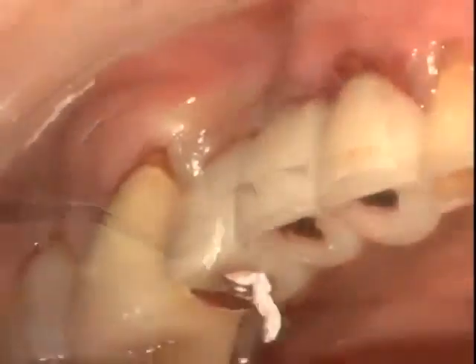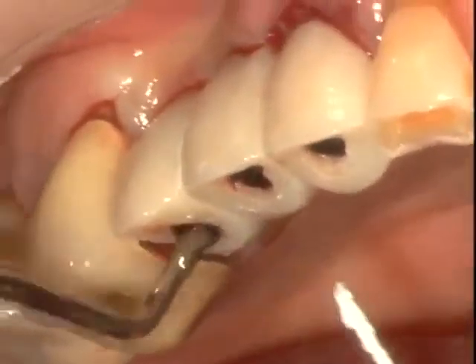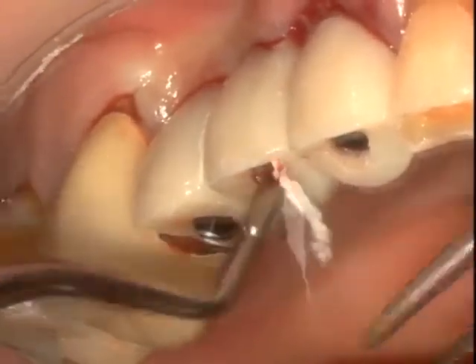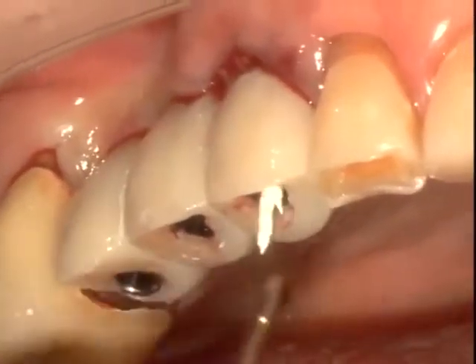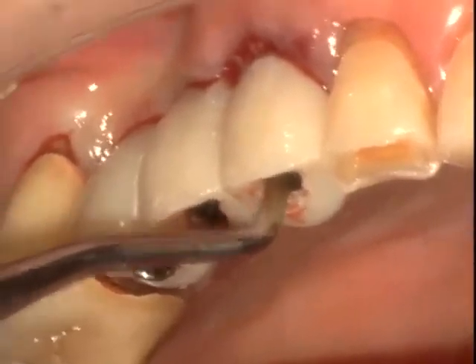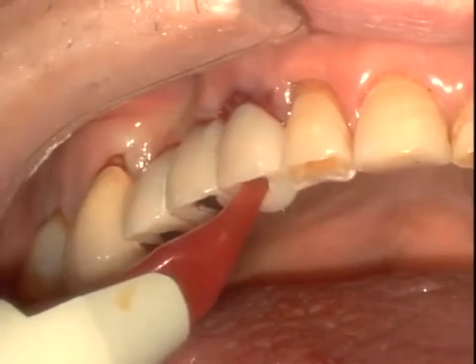This just simply protects the screw from overlying filling material. We can either use composite resin or Fermit, which is a light cured material. And this Teflon material simply acts as a protection for the screw so that we can easily gain access to it after we seal it.